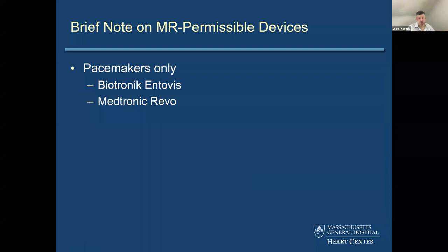So when I first prepared this talk, there were only a few MR permissible devices. They were, in the early days, Biotronik and Medtronic. These days all manufacturers have MRI conditional systems, but just keep in mind that depending upon the era in which a pacemaker was implanted, depending upon the pulse generator or the leads that were used, you may or may not have an MRI conditional system. Just keep this in mind.